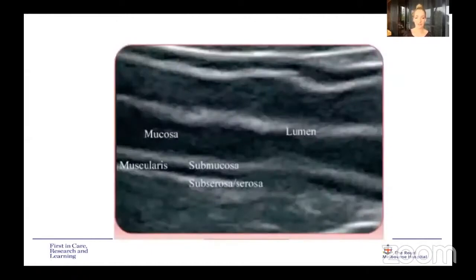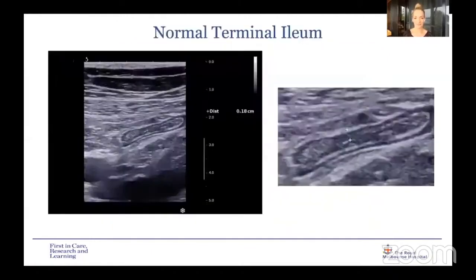That's just a close-up of exactly the same thing. As you can see, once you get your eye in, the bowel really does stick out for you. Most sonographers are trained not to see the bowel at all and to try and ignore it. But for us, this is what we're looking for. And then you can get in close up and measure that bowel wall thickness.